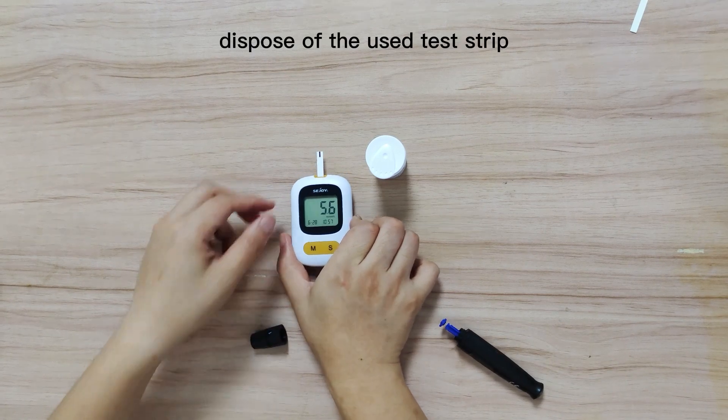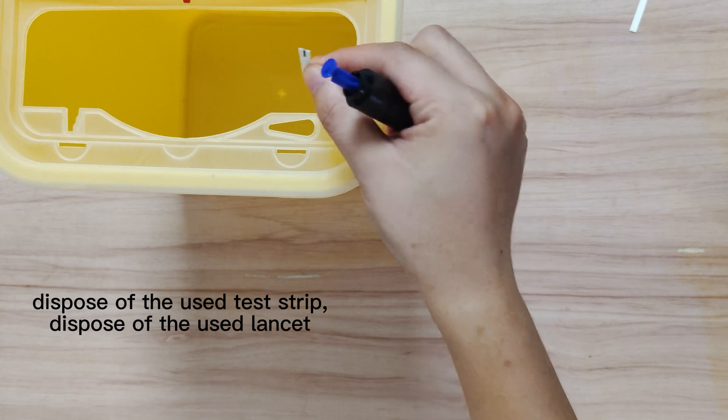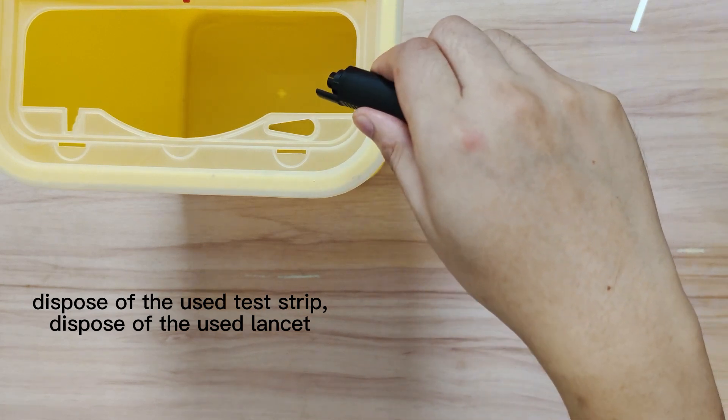Use the test strip ejector switch to quickly dispose of the test strip.